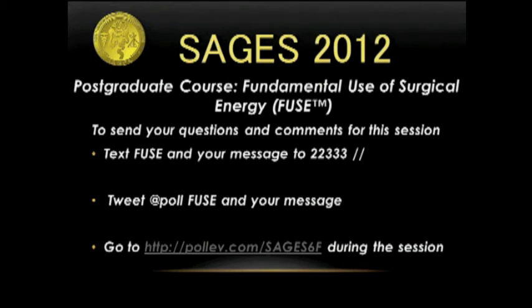Thank you. I have a question for Charlotte. What does the healthcare quality team require to ensure a suspected generator is acceptable to be put back into service after an adverse event? Well, each device has a manufacturer's suggested maintenance schedule and suggested PMs that have to be done on the device. So you depend on your biomedical engineers to take them through the steps to show that they're working properly. We also look into, for example, the ECRI databases to see whether this device has been suspect in other things as well. So those are the things that we use: good testing, good function, and looking into the literature to be able to say a device can go back into service.